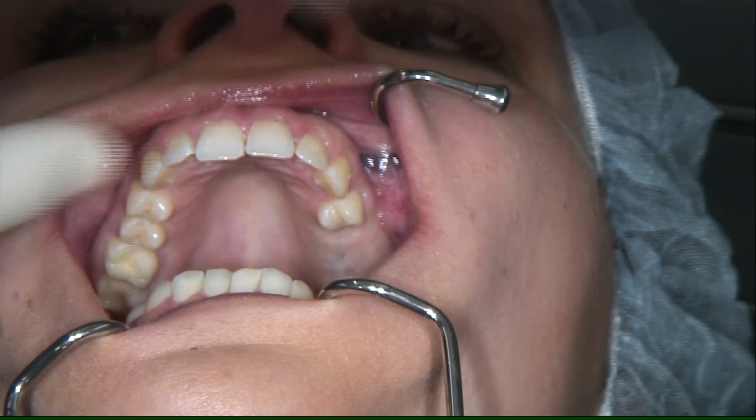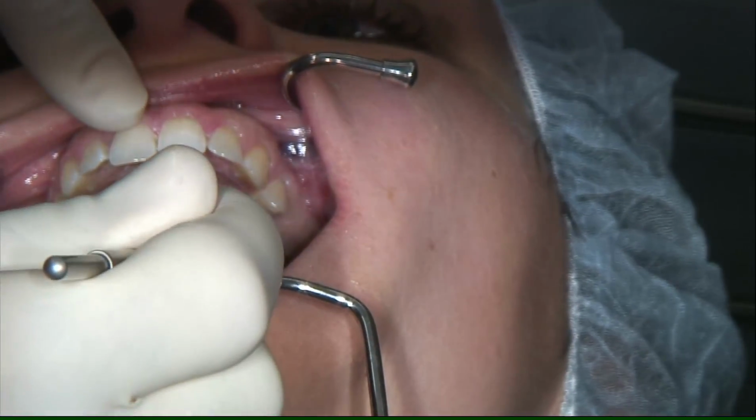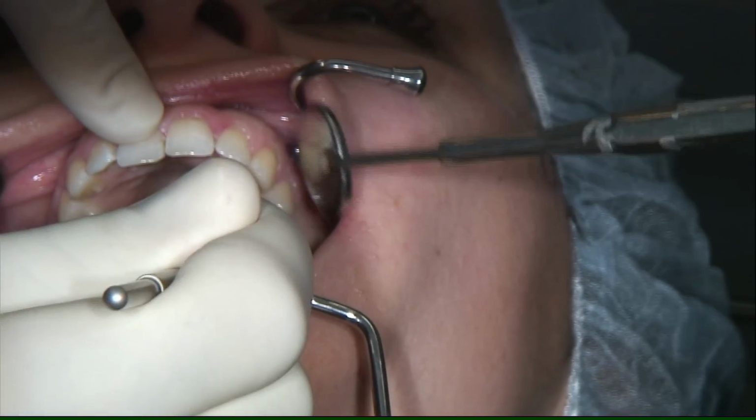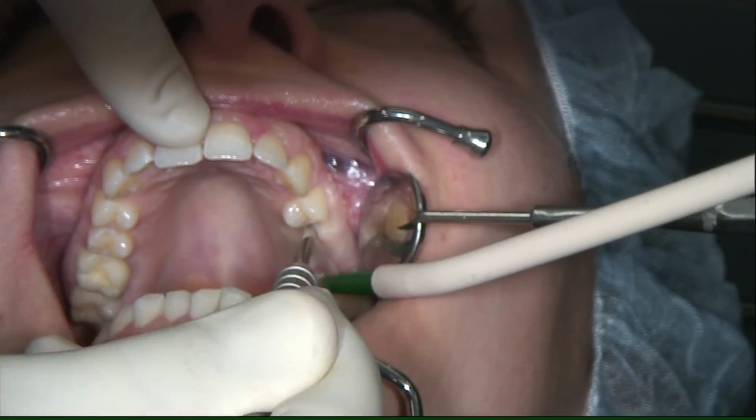Socket preservation was performed four months ago in this area with allogenic bone. We do a crestal incision.